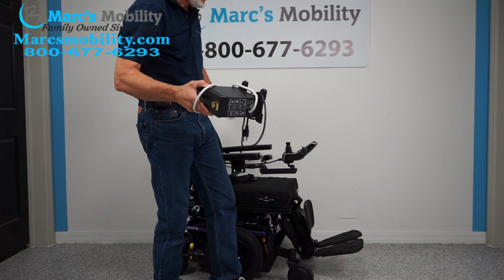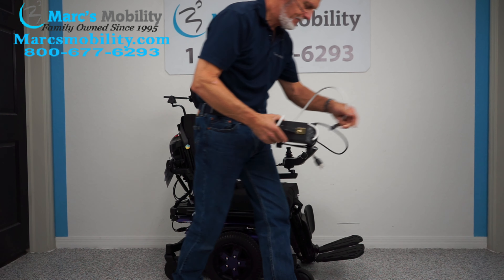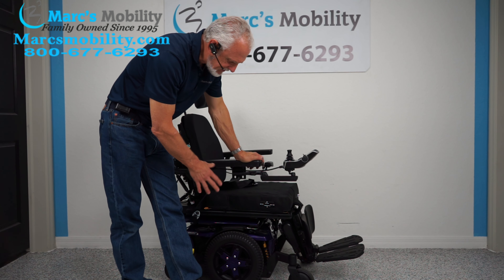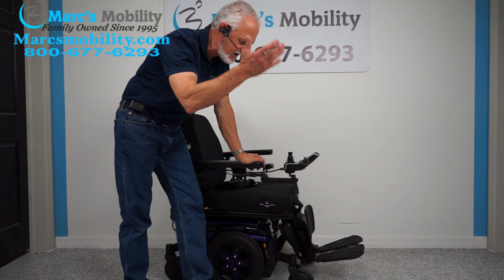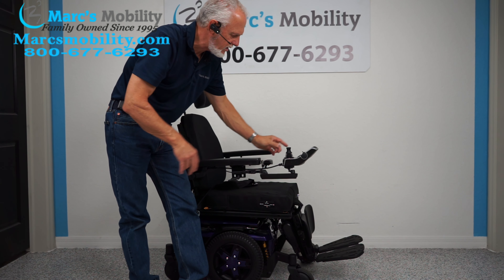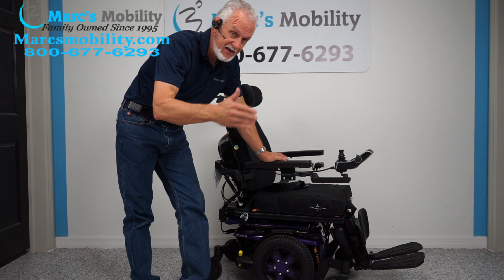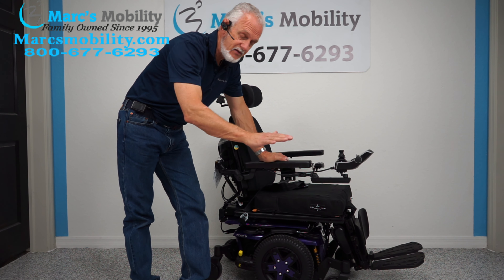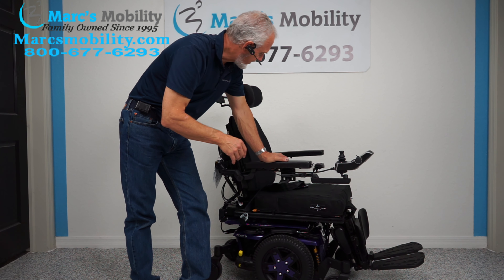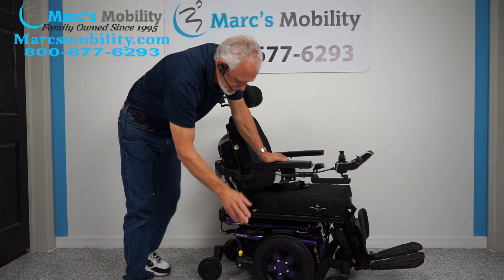When you charge this chair, take your Quantum charger that comes with it and plug it right below the joystick. As soon as the light turns from orange to green, it's fully charged. There are two batteries in these Quantum chairs and they come out from the front — you'd have to have the seat tilted or elevated to access the front cover, then both batteries come out from the front. They're supposed to give you about 15 miles on a battery charge, but that could be less or more depending on whether you're going uphill, outside in the grass, how fast you're going, or how many functions you use.